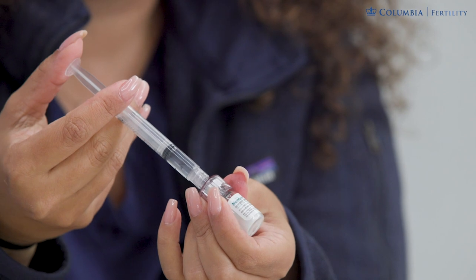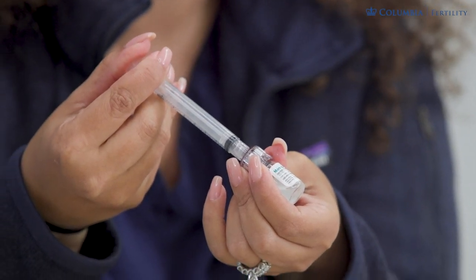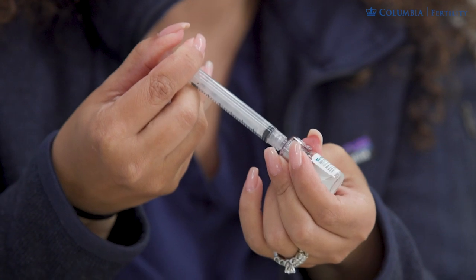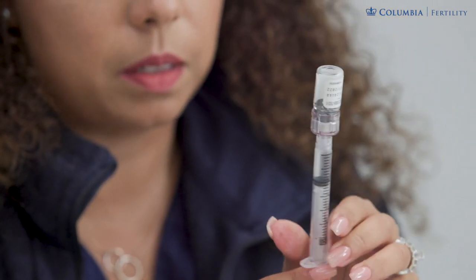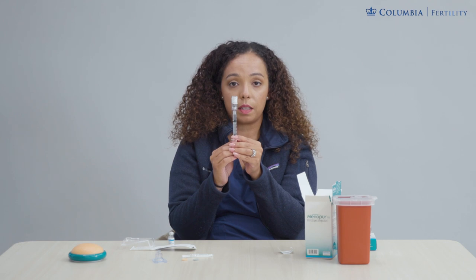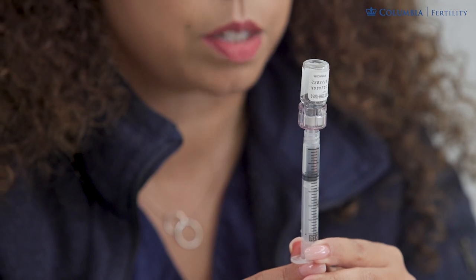Once the vial is off, take this one milliliter and push it into your powder vial. Once the powder vial is connected, push in the liquid. The powder vial mixes instantaneously — there is no shaking or agitation required. Once you are done pushing in the liquid, invert the vial and draw out all of its contents. You will still have that one milliliter of fluid, which is now your mixture. If your dose requires more powder vials, continue diluting all powder vials with this mixture before injecting.